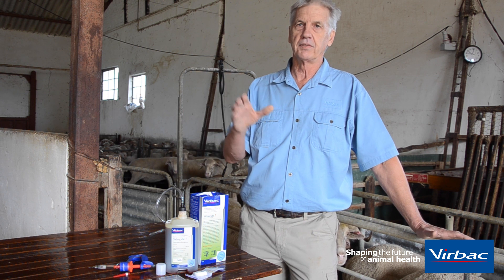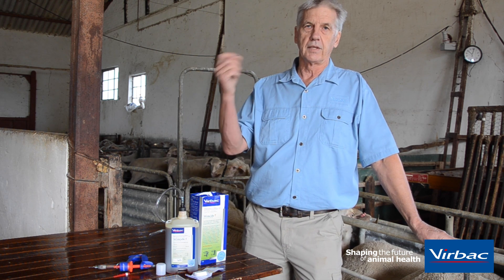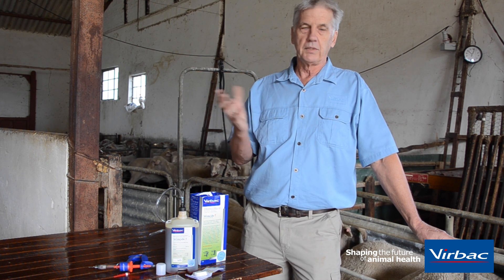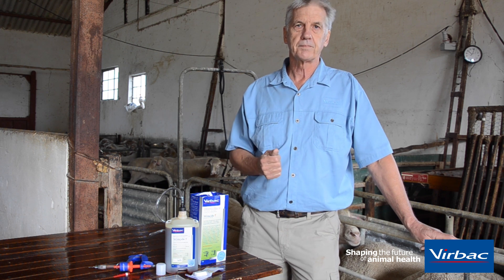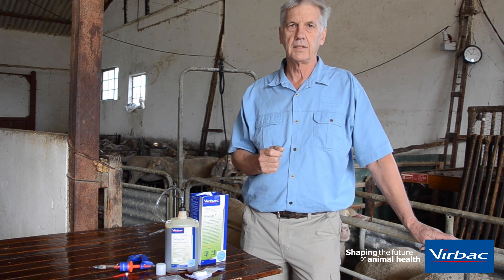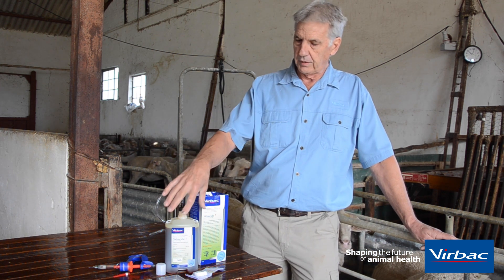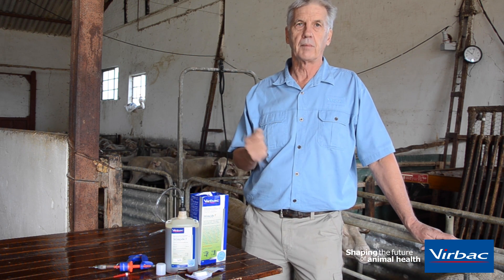When we inject sheep, we have to realize that there are different injection sites and different drugs — some are more viscous than others. That will influence the type and the length of needle that we use. There are also drugs that may stain the wool, so for that we'll try and use a longer needle. The sites where we inject sheep are either under the skin or intramuscular. For intramuscular we normally use a slightly longer needle than for subcutaneous. But if it's something that may stain the wool, like this product here, then we'll use a slightly longer needle for the subcutaneous injection as well.